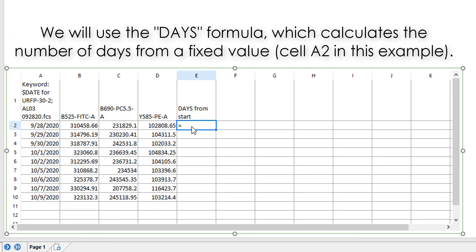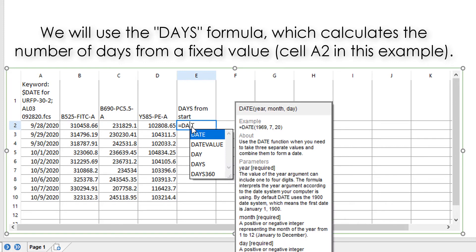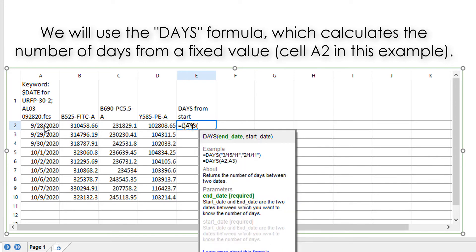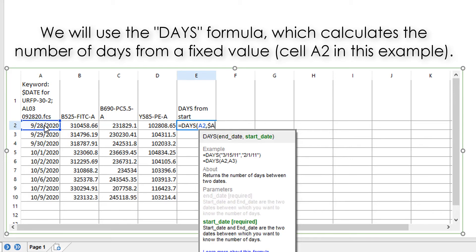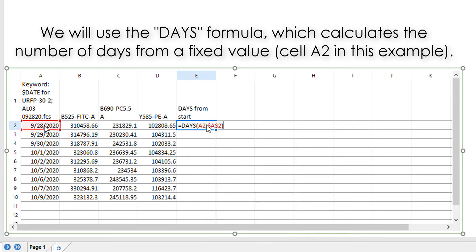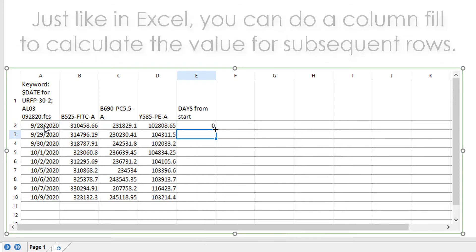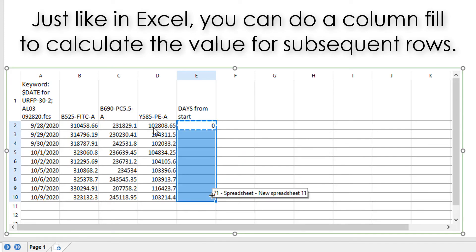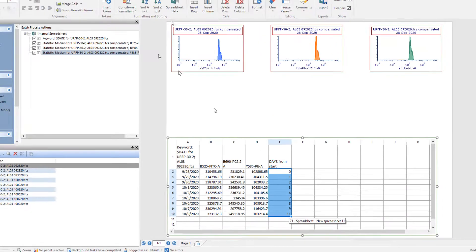Use the days formula, which works the same as in Excel, and do a column fill to fill the days from start for the rest of the rows.